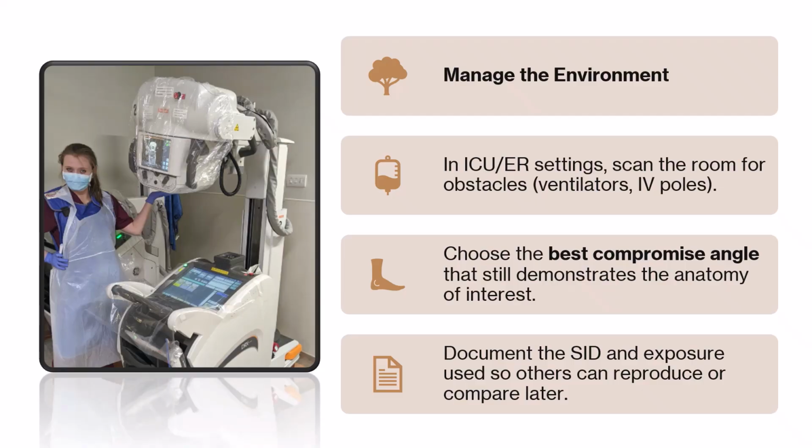Obviously, manual technique is usually required outside of the department. In ICU, surgery, NICU, all these types of environments have challenges.